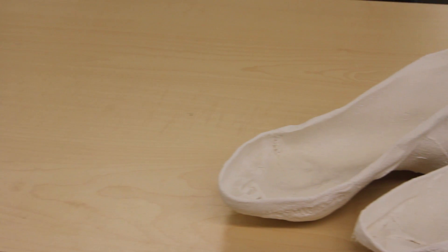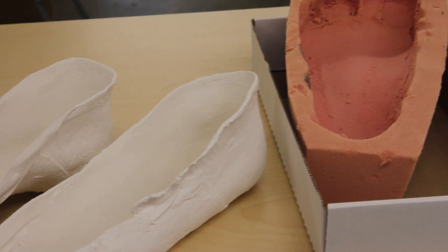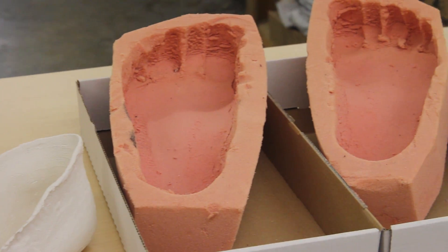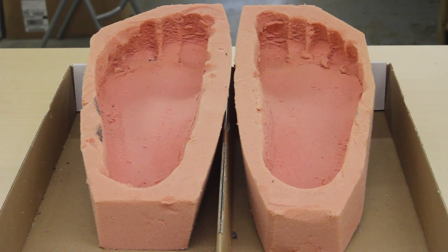A custom made foot orthotic is made from a three-dimensional model of a patient's foot and is fabricated from raw materials. It is designed to meet the patient's unique and specific needs. At Kintec, we use a variety of techniques including plaster slipper cast and foam impressions.